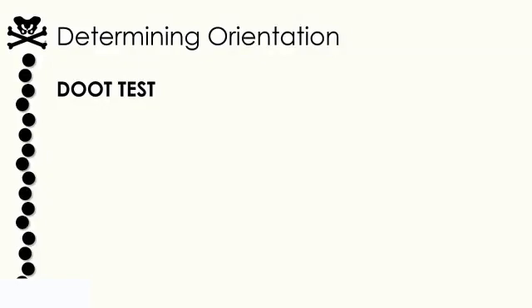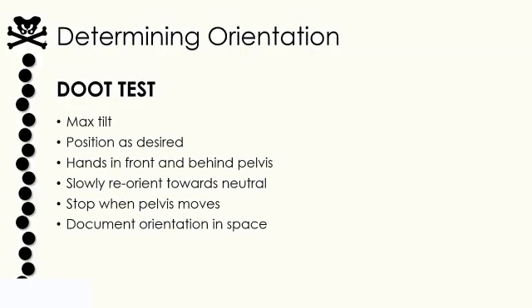So you put your first initial in that first spot, and then this will be your test to determine optimal orientation. And this is how it goes. You're going to tilt the patient all the way back, whether it be in a manual chair, where I'll just support them or lean them back onto a mat table and guard them for safety, or a power chair, where we can obviously use the power functions. You're going to tilt all the way back. You're going to manually position them, or have them reposition if they can do it independently, ideally in the ideal alignment.